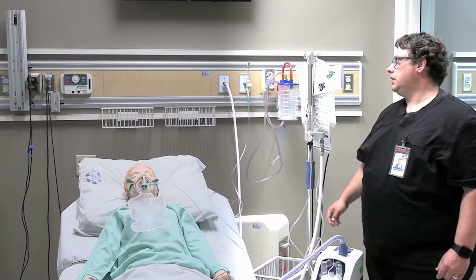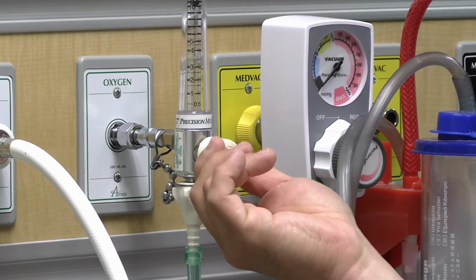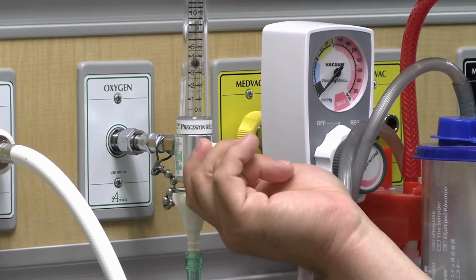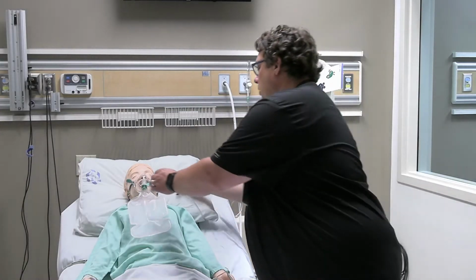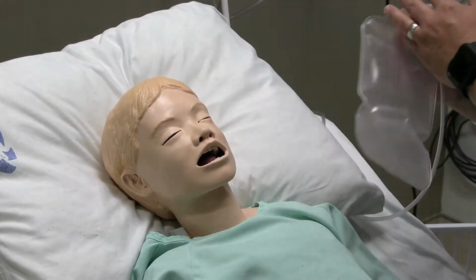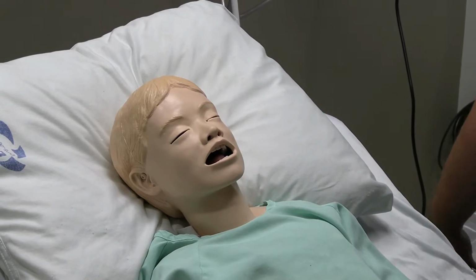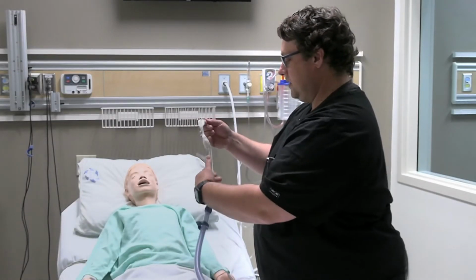So we are going to come over and just turn off our flow meter, because we will be using the flow meter from the AIRVO for this patient here. We'll remove the non-rebreather. We likely will keep it at the bedside in case we have any clinical indication for it. And then we'll now apply the nasal prongs to the patient.